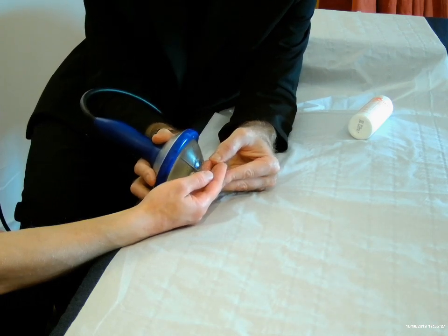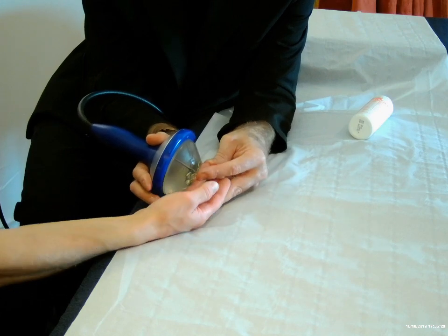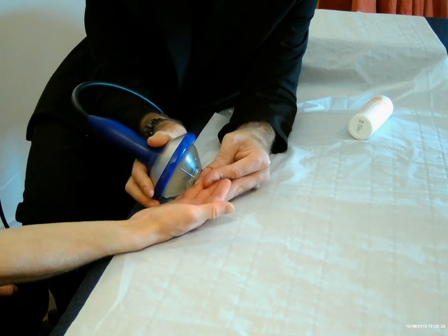We're still on the ulnar collateral ligament, but just going on from a slightly different angle.